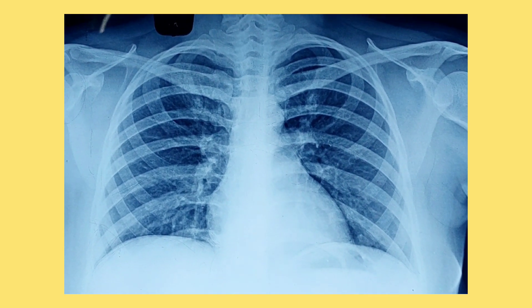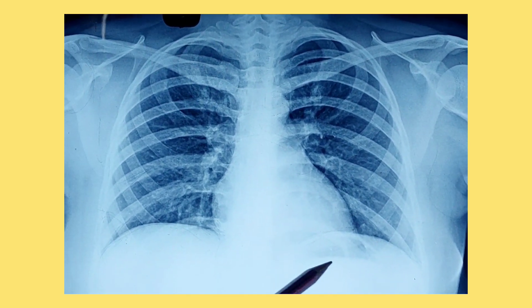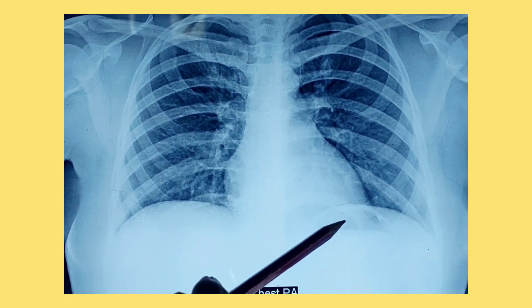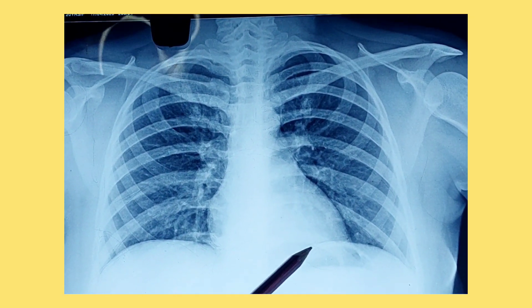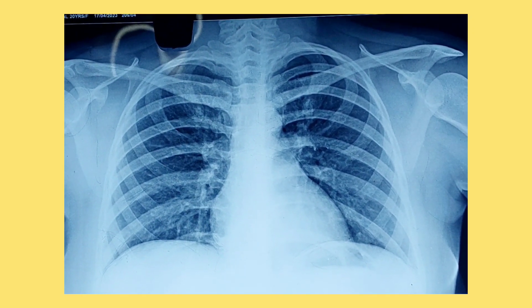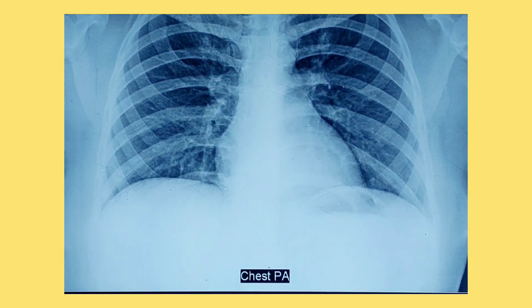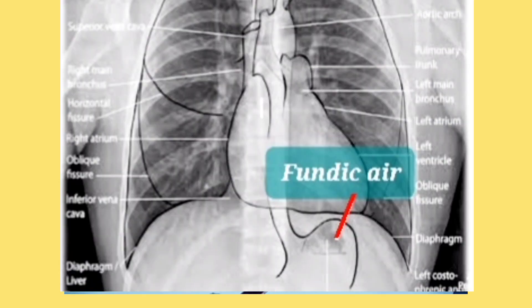Another thing that may be asked: can you see this black area? It is not prominent in this x-ray, but in some x-rays you will see that a particular area below the diaphragm looks black or dark. This dark or black area means air is present — this is the fundic air, which is air collected within the fundus of the stomach.